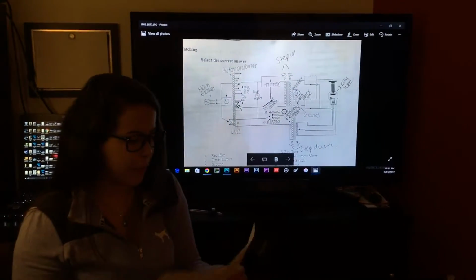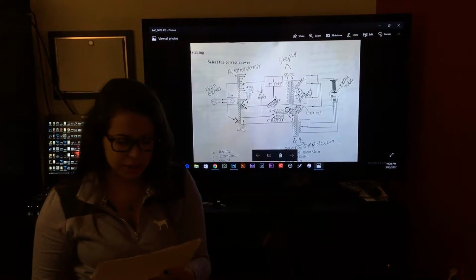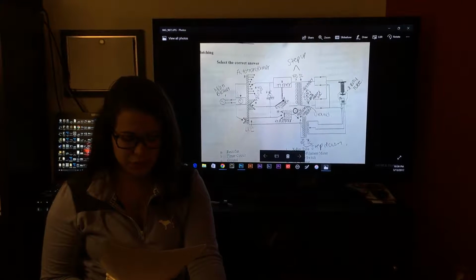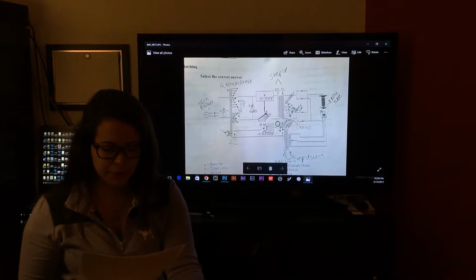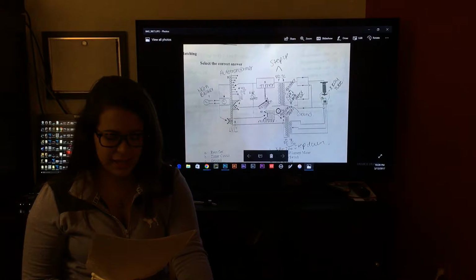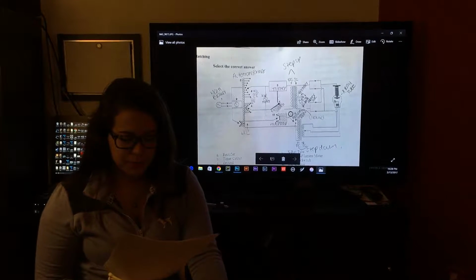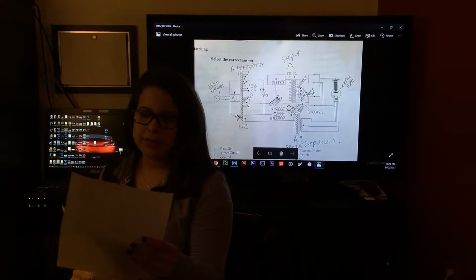Let's go over the radiation detectors. All AEC devices work by the same principles. Radiation is transmitted through the patient and converted into an electrical signal to determine the exposure time. This occurs when a predetermined amount of radiation has been detected, as indicated by the level of electrical signal that has been produced. The predetermined level of radiation is calibrated by service personnel to meet departmental standards of image quality. So that's part of the AEC chambers.